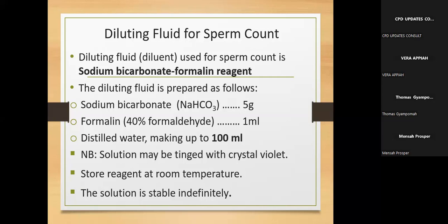You know the Turk's fluid. Who knows about Turk's fluid and what is it used for? Somebody should help me. Turk's fluid, T-U-R-K apostrophe S. What is it and what is it used for?